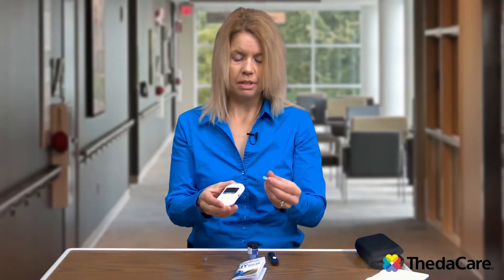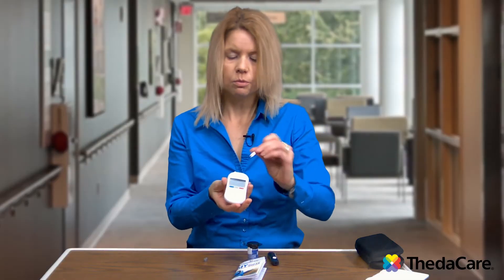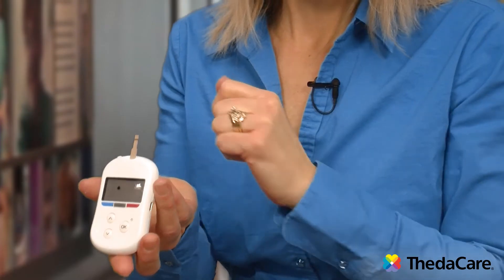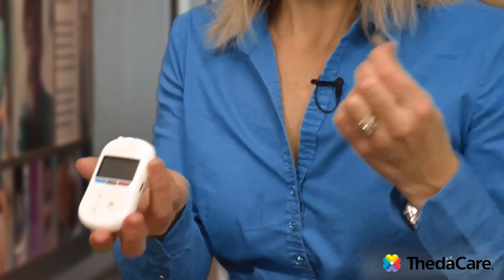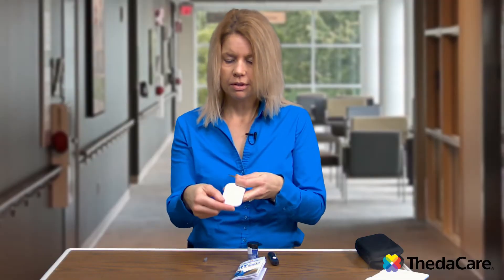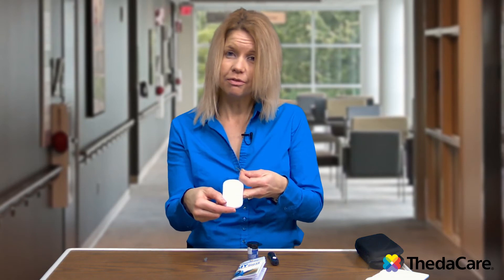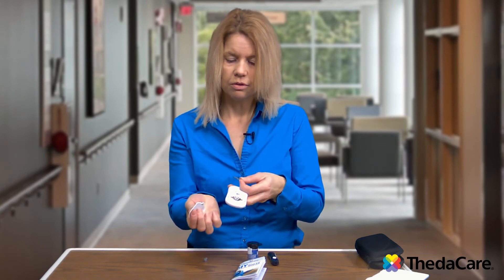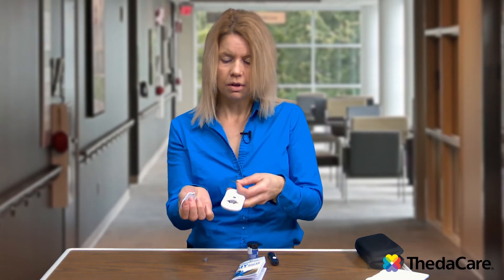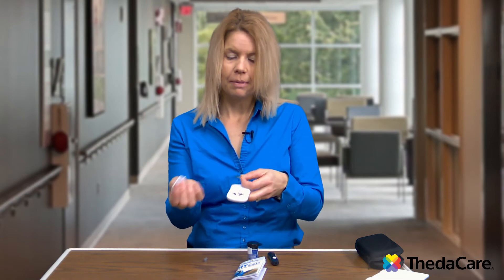When you place the test strip into the glucose meter, the meter will turn on automatically, so you do not have to do anything. When you take that test strip out, it will turn off. On the back of every glucose meter there is a 1-800 number for that company, and also the pouch where the battery goes. If you have any troubles, you can call or change out your battery. Batteries do tend to last for over a year, so most people don't have too many issues with them.